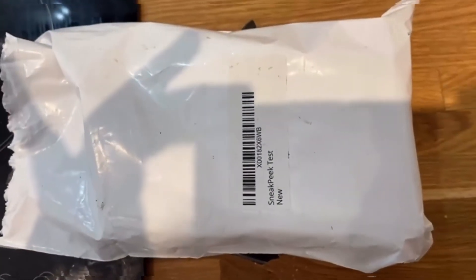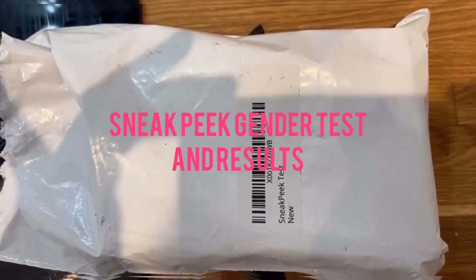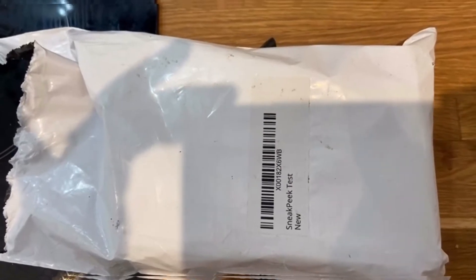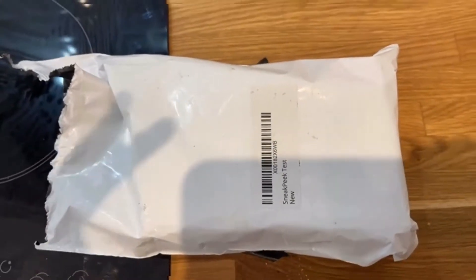Right here it is — I've just received the SneakPeek test to find out the gender of the baby. I'm now about 13 and a half weeks, so let me get this out of the bag.